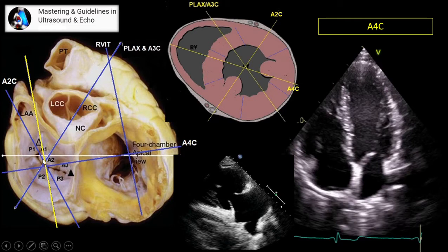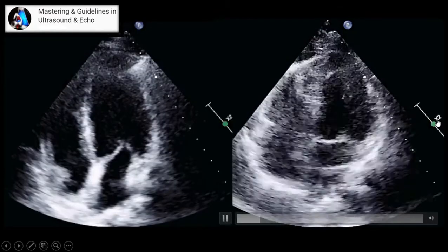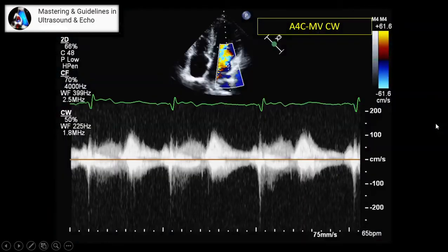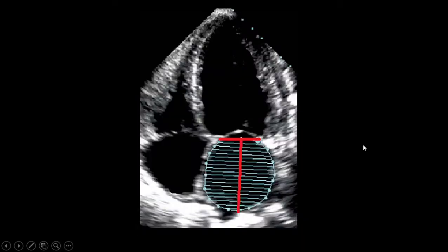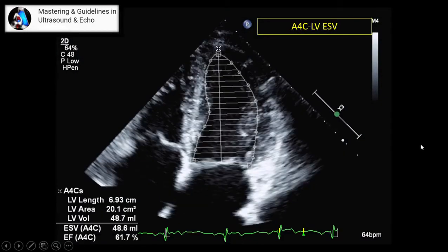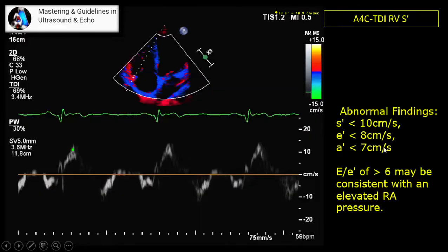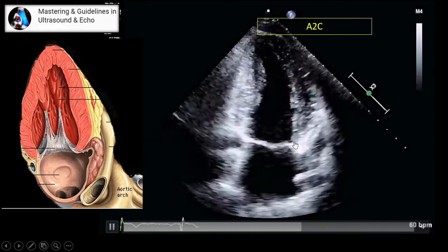The only important things for apical 2: first of all, you have to get a crescentic apical left ventricle, and during scanning, you have to sweep the mitral valve leaflets. In other words, when you are getting apical 2, just fan a little medial and then lateral and sweep all the way through the mitral valve leaflet, if there is anything.